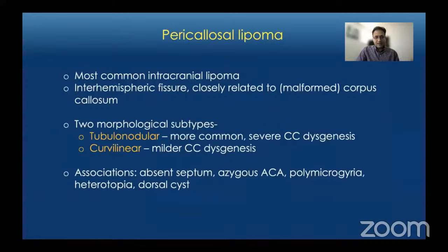Pericallosal lipoma is the most common location for an intracranial lipoma. It occurs in the inter-hemispheric fissure and is closely related to the corpus callosum, which is often malformed. There are two morphological subtypes: tubulonodular, which is more common and often associated with severe corpus callosal dysgenesis, and curvilinear, where there is a thin band of fat along the corpus callosum that may be normal or only mildly affected. Other associations include absence of septum pellucidum, polymicrogyria, heterotopias, and dorsal cysts.